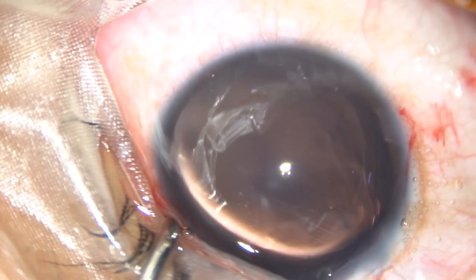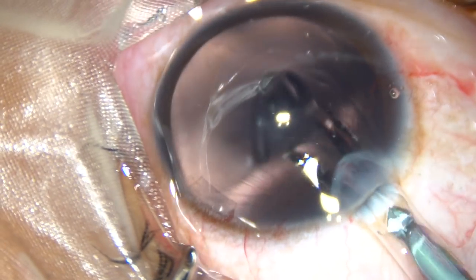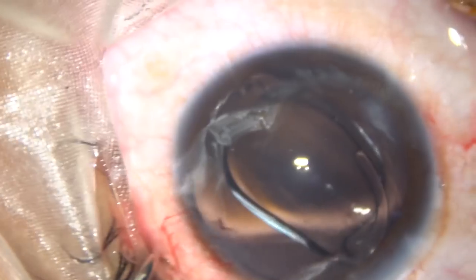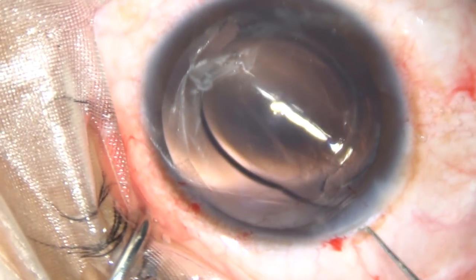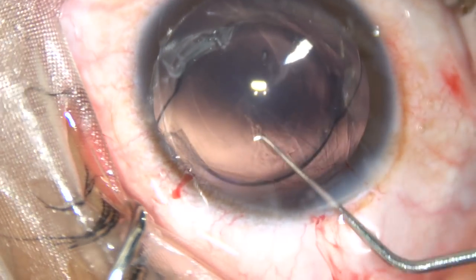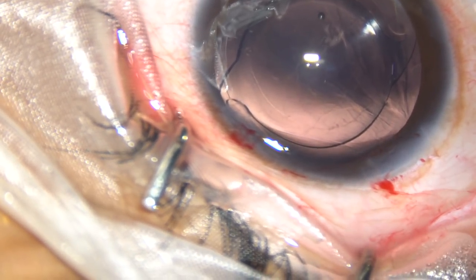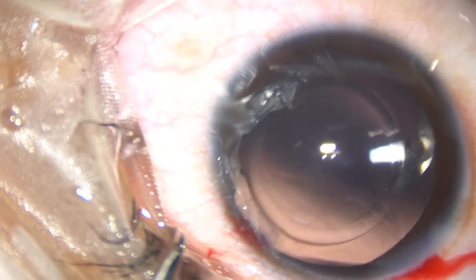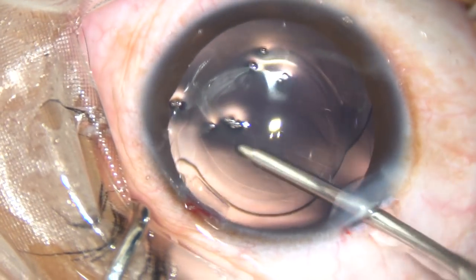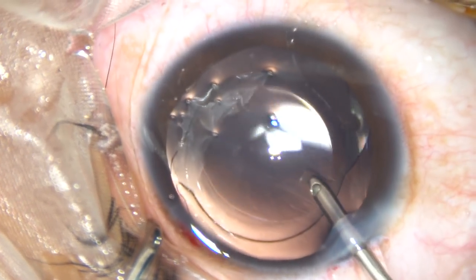We will do that after implanting the intraocular lens. This is a hydrophobic, monofocal, aspheric intraocular lens — the Tecnis 1 from Abbott Medical Optics. This is a 6.5-diopter lens and the target refraction is minus 0.25 diopter. We have an optical biometer, LenStar, from Haag-Streit.